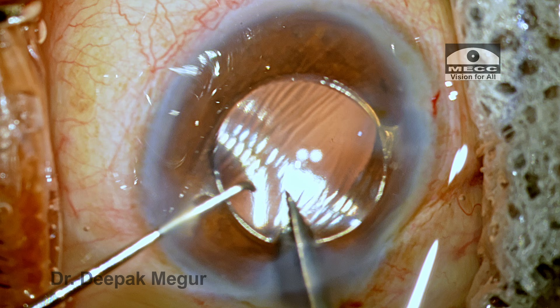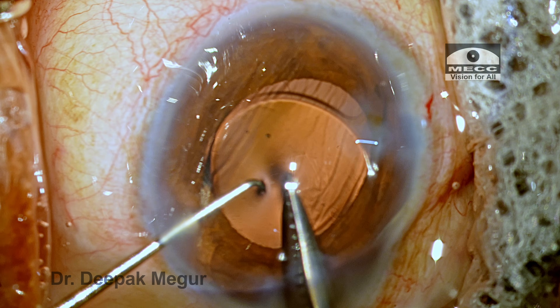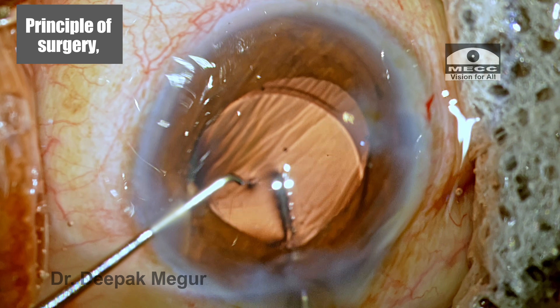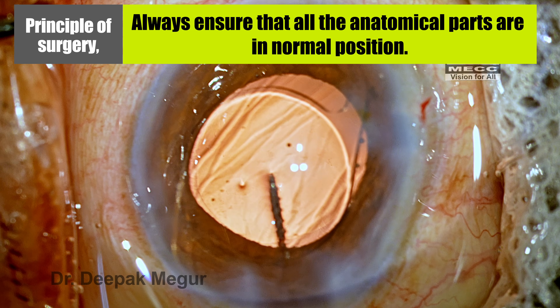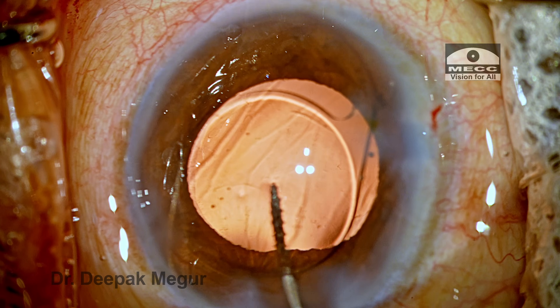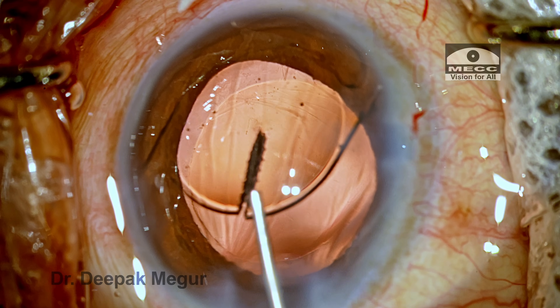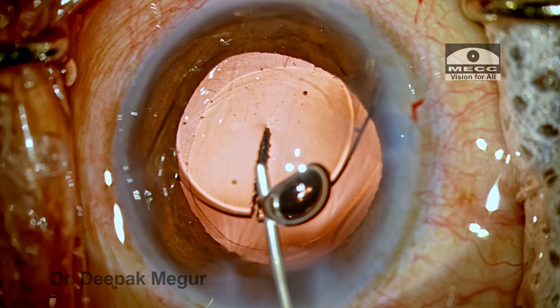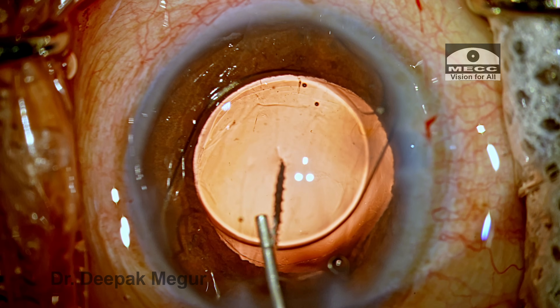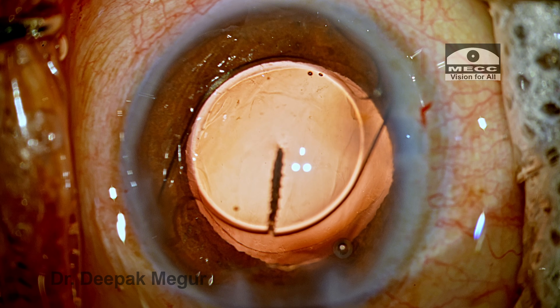Because I saw the corneal folds and felt uncomfortable, I didn't go full thickness through and through — I just made a partial cut and came out. The idea was to replenish the OVD in the chamber. Remember the basic principle: always ensure all anatomical parts are in their normal position. Whenever we see a compromise, come back and restore everything to the right place. The OVD is now replenished — you can see the cornea is taut and the anterior chamber is well formed, giving enough space to maneuver.